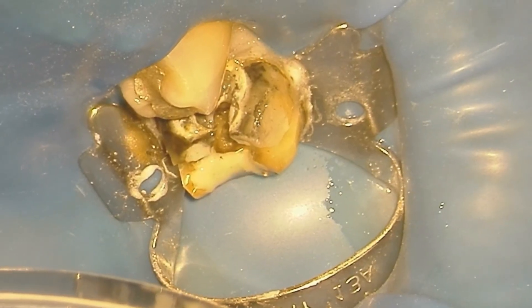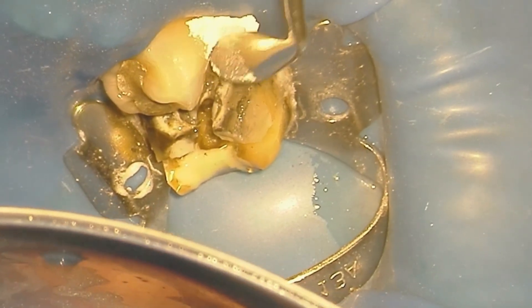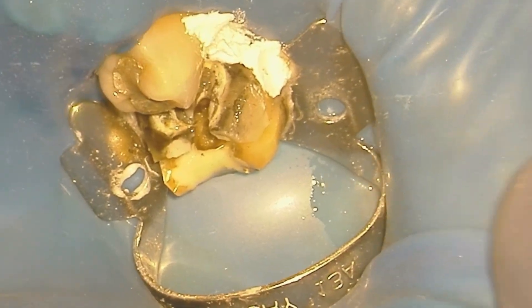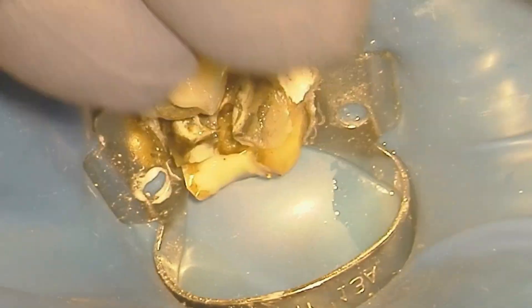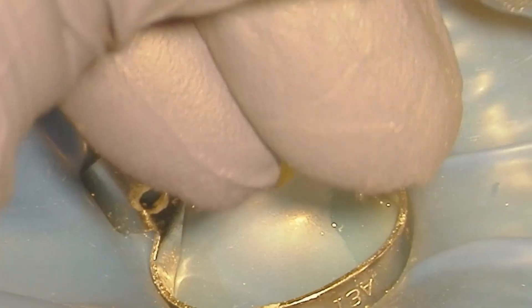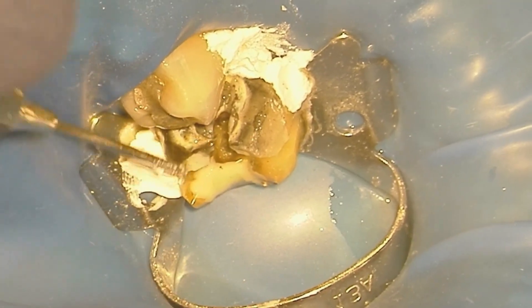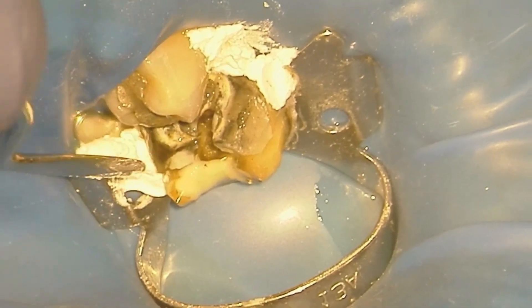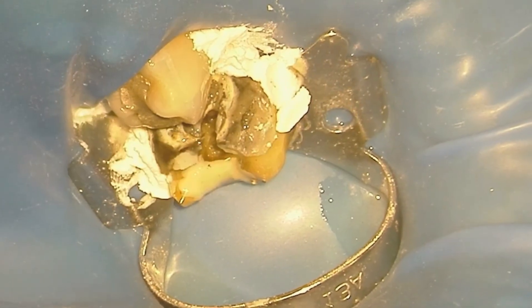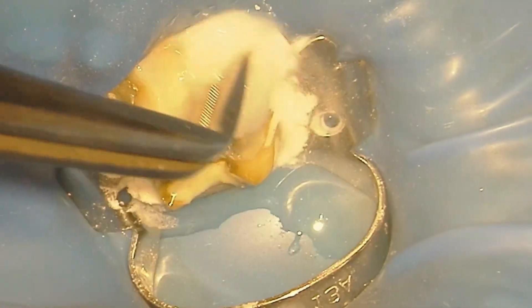We're going to take a click and relieve the pressure on the frame of the handy dam. You'll notice here I'm going to place a little caulking and then stop and relieve that pressure on the edges. The magnification on the microscope doesn't allow it to see it all the way. I like to use the Ultradent caulking agent — it's fairly inexpensive. You can use a variety of different ways, but what you want to make sure is you seal any of those probable access areas that either sodium hypochlorite or saliva from the patient's mouth might seep in.